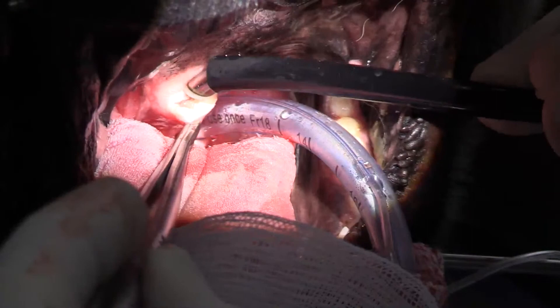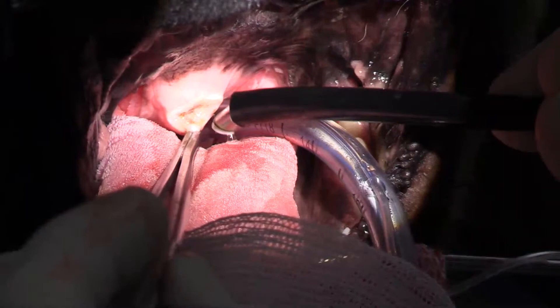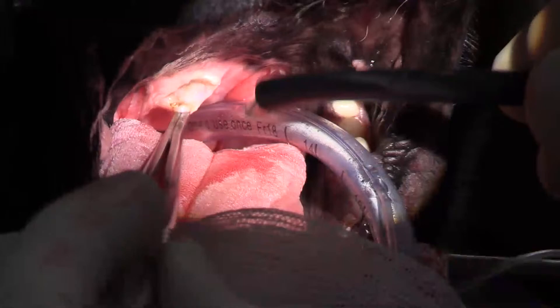This coblation unit creates a plasma field around the end of the probe and vaporizes the tissue. ENT surgeons use them in human medicine for tonsils frequently because it significantly reduces the amount of inflammation that you get. You can see we're cutting that away.